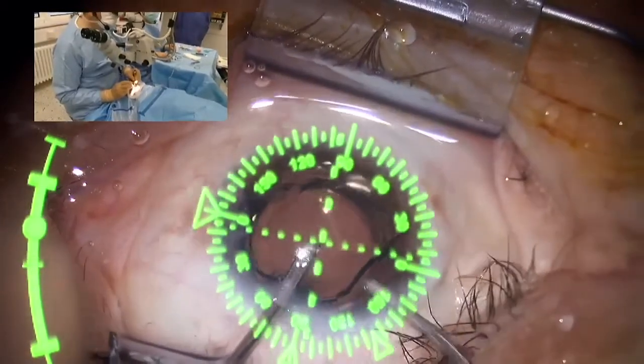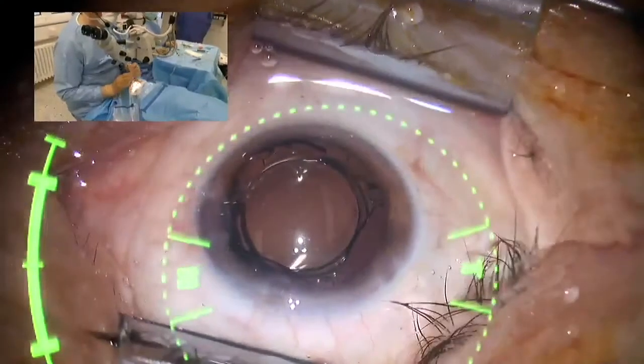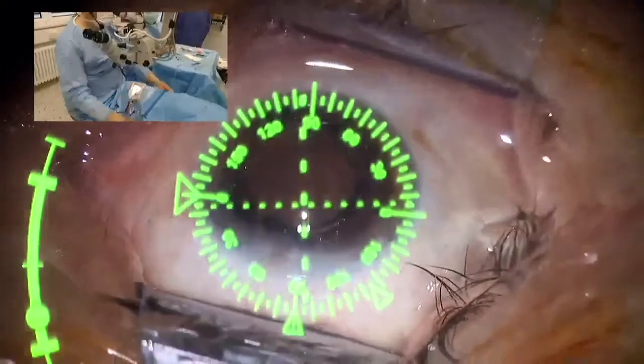Wasser? Oh, ich hab. So. Okay. Ganz locker. Und zu mir mal schauen, bitte hier hoch.